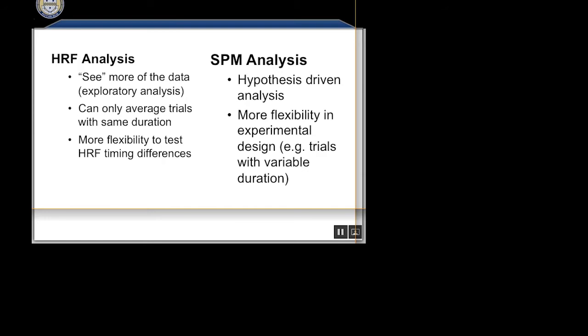So you can do a full deconvolution, look at the whole time course, and then choose a tapered window that had the shape of the canonical response, and you would have gotten the exact same t-value as if you did it over here. The advantage over here is you're jumping straight to that answer, so there is a little more advantage in power, weighting it by time. And I'm glad you asked that question, because it's exactly something that the NIRS field has criticized the fMRI people about.